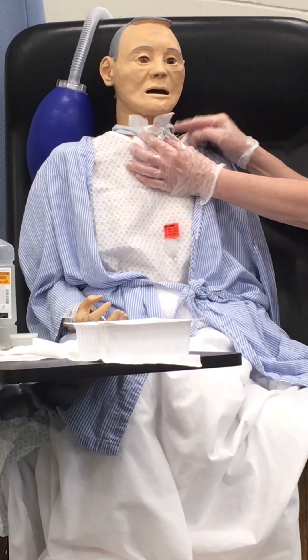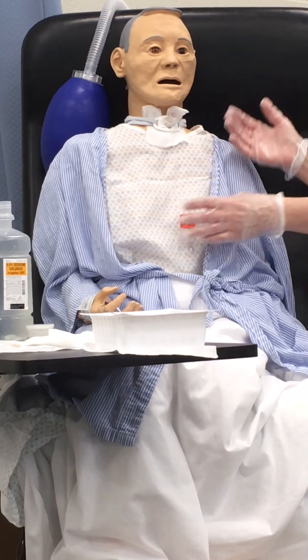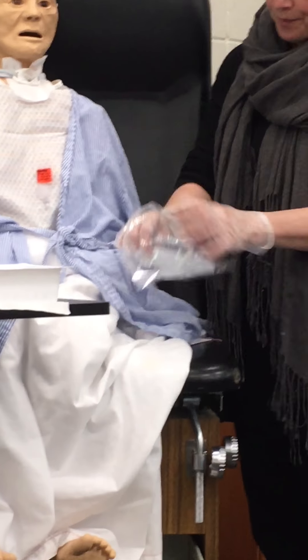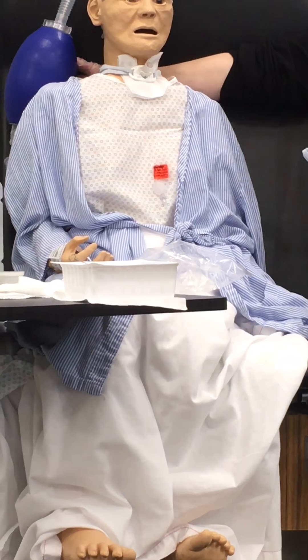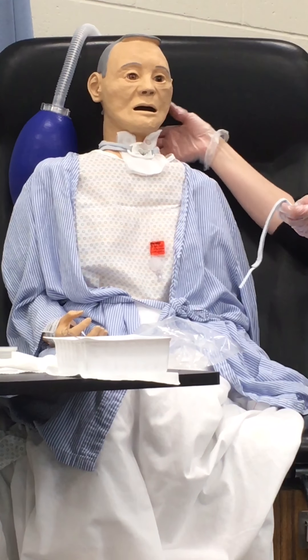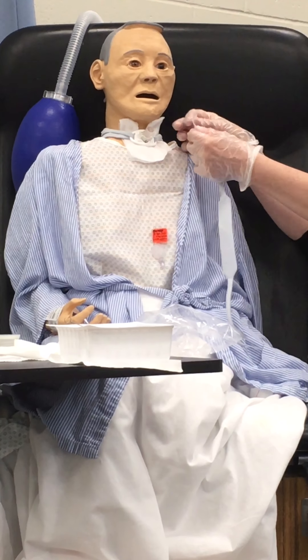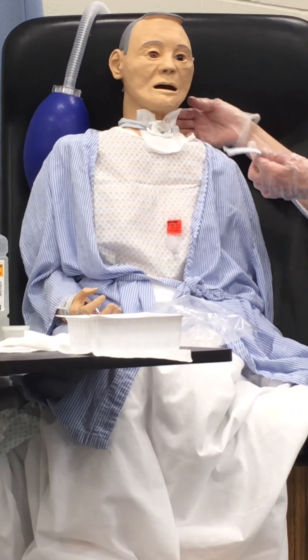If I have to loosen this, I'm going to hold the trach — holding it, loosening it in case she coughs. The rule is only one side can be undone at a time. Holding. Jane, you doing okay? Secure makes her feel secure and it doesn't tickle as well. And then one finger breadth. The only thing I have left is changing those trach ties. I'm going to take my gloves off, put new gloves on, and then trach ties. A little trick: you can have your patient's pillow up a little bit so it creates a little space back here, especially if they have long hair or you don't want to hurt their skin. We have the foam trach tie — it has options of smooth or rough.